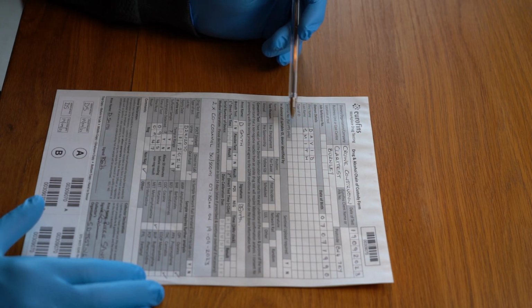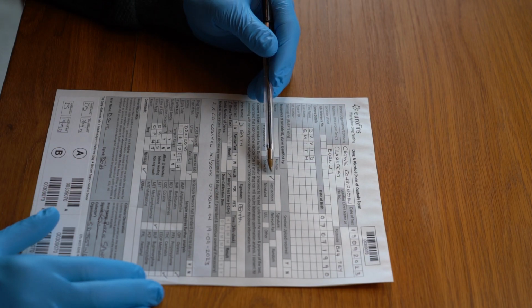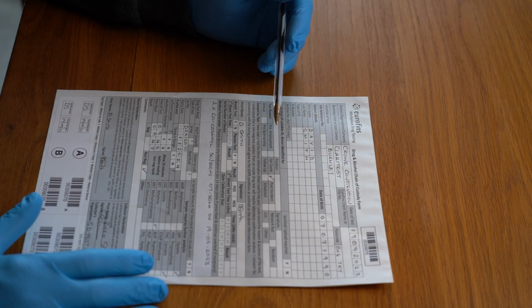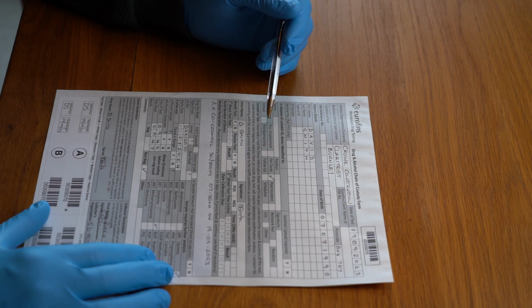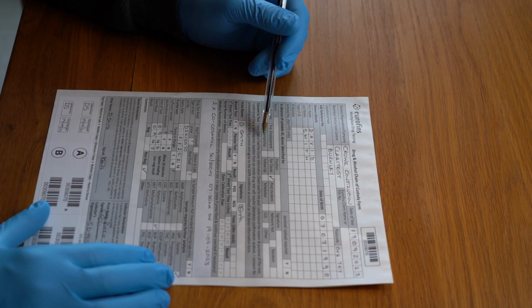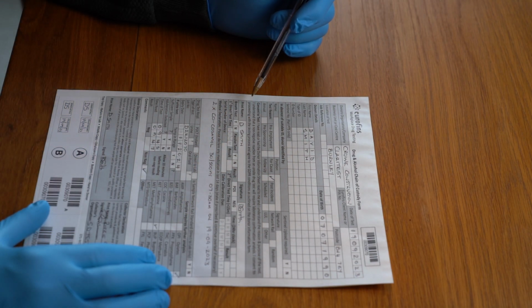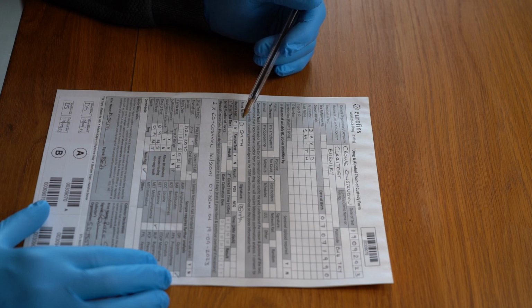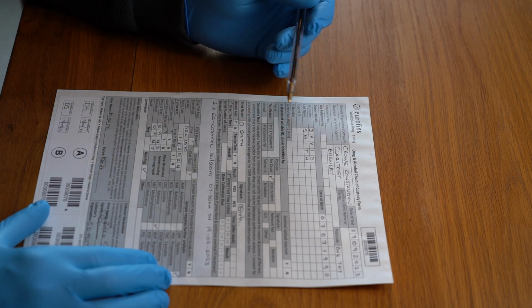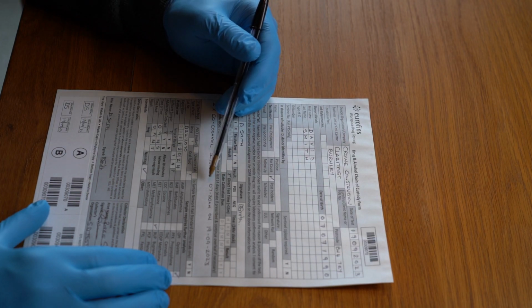So after first and last name, you're going to need to move to the reason for test. So the reason for this test was a for-cause test, but it could be something like pre-employment, post-incident, random follow-up, or some other reason. If there's another reason that isn't listed there, you'll need to write that in where it says other. You then read the donor consent to test, and once you've read it, if they agree to the test and they agree with the statement, then you simply ask them to print their name, D. Smith, and you ask them to sign it. Forget the next bit once again, because you're not going to be filling any of the details out.